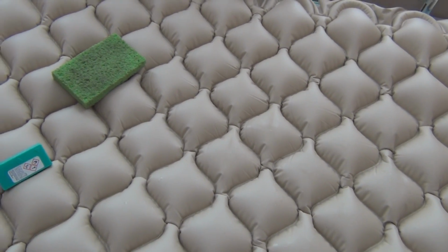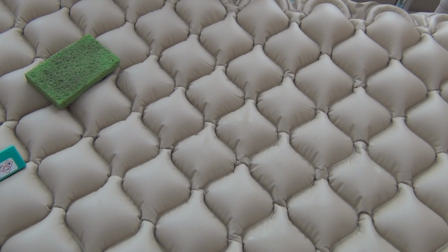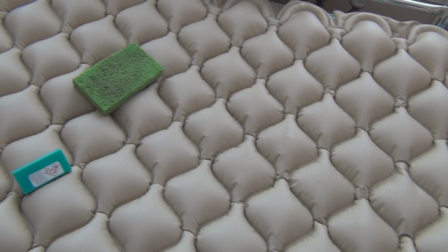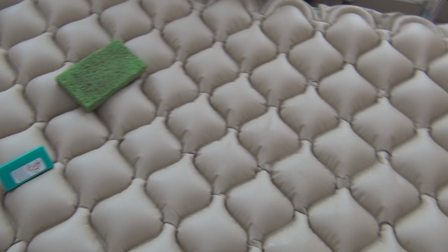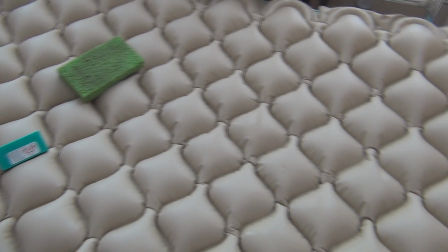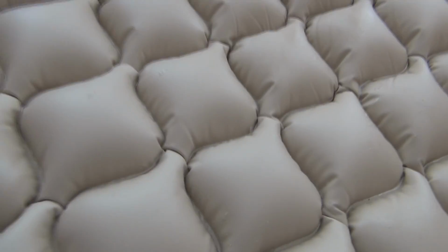been a week and already, like I said, these sores can really get serious very quickly, and a bed sore has already developed. So I didn't want to wait any longer, even though it looks like I might eventually get the one through the insurance, the medical supply place. So this is what it looks like.